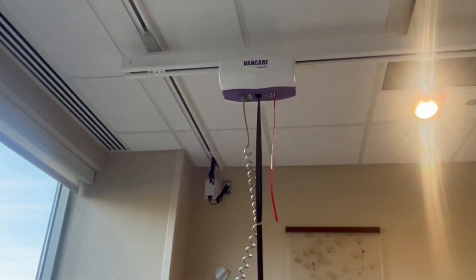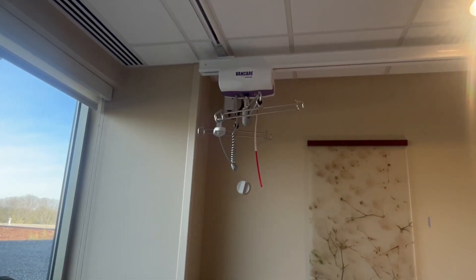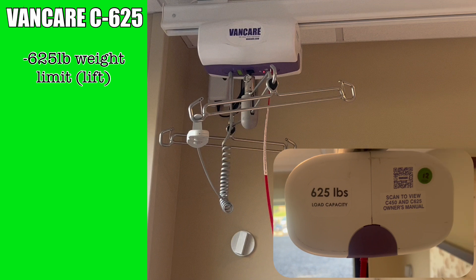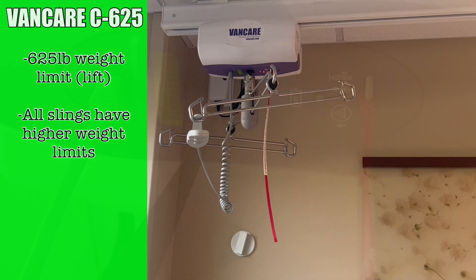The lift system is comprised of three components: the track, the lift motor, and the sling. We'll begin by looking at the lift motor. In rooms with a motor installed, you should find it docked to the charger in the back corner of the room near the window. The lift is a VanCare C625. The 625 in the model name refers to the weight limit — this lift can hold up to 625 pounds, which is the limiting factor, because all slings used at Trinity Health Livonia far exceed the 625 pound weight limit.